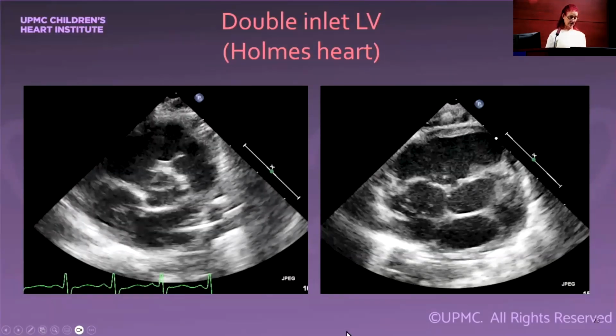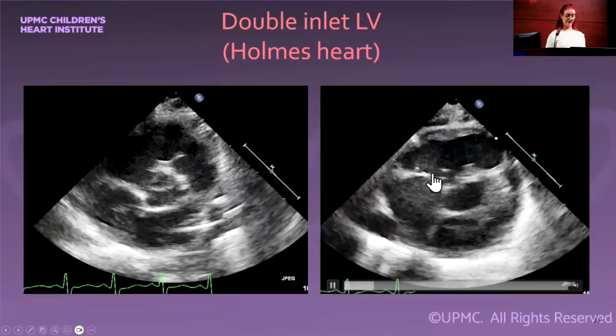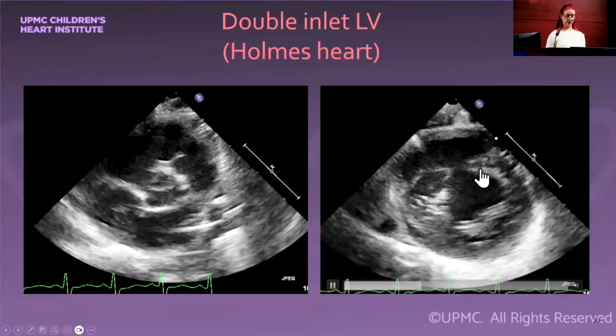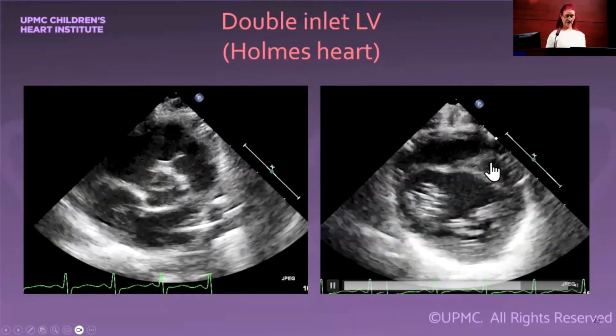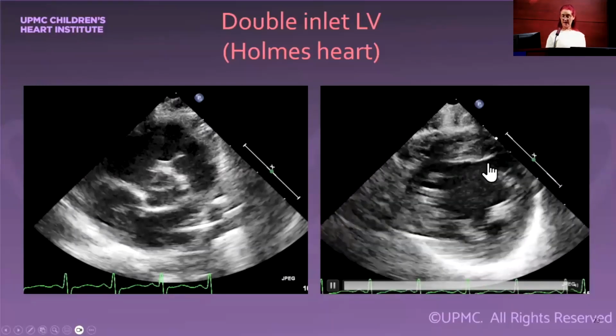So again, to show you this one as a sweep, this sweep starts right below the aortic valve, so this would be your anterior RV, and as you watch, this anterior AV valve has attachments to the crest of the septum, and as we watch it come all the way down, sometimes it's hard to tell whether you're dealing with a papillary muscle in these dominant ventricles versus a septum. So what I do is I want to follow it to see if it ever completes the wall.